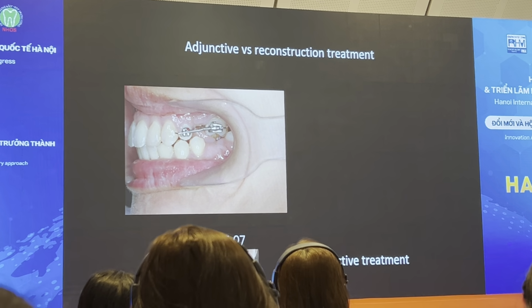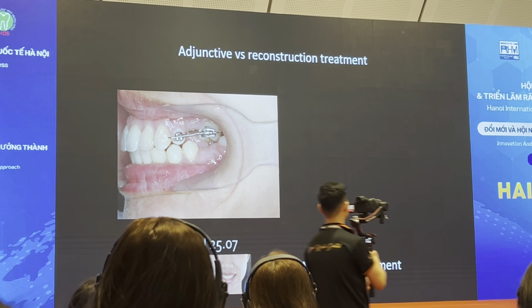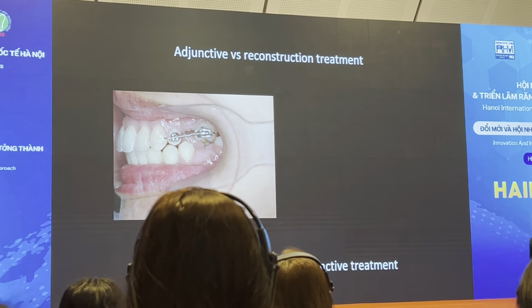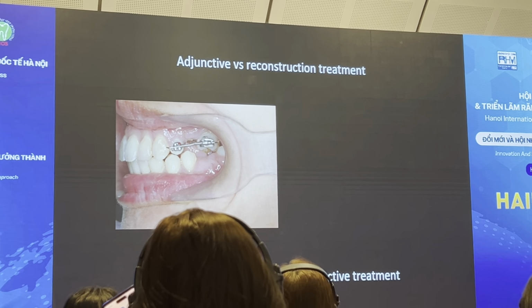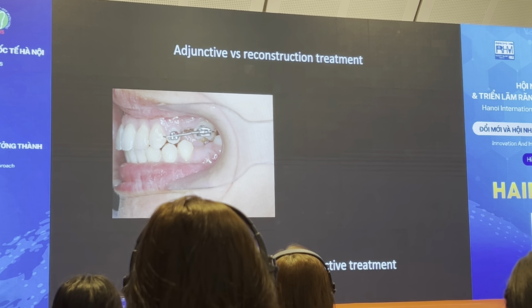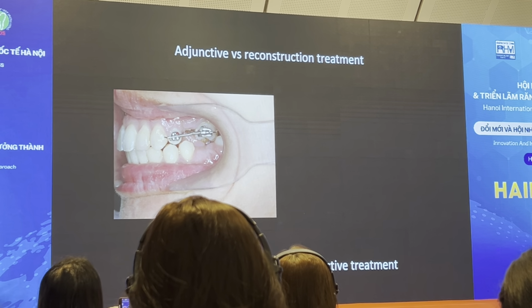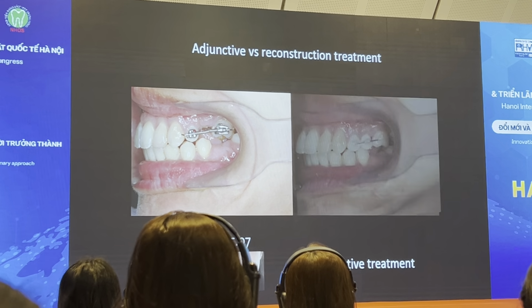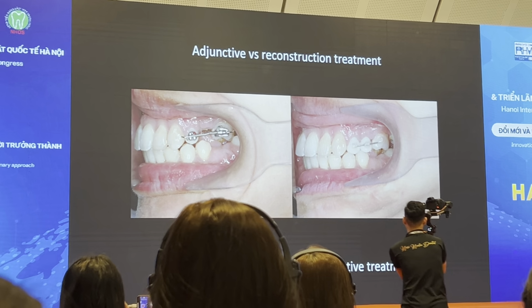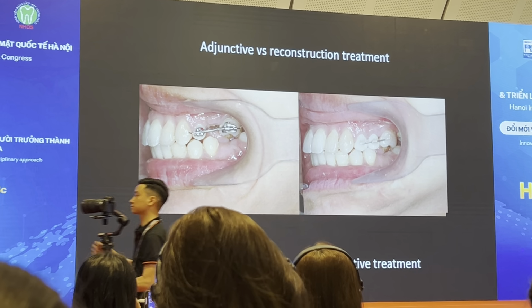A good example is the treatment I provided for Rachel after her comprehensive orthodontic treatment. I bonded the brackets to the implant-supported crown at 2/4 and to 2/6. A stainless steel wire was fully engaged into the bracket slots passively, and an opening coil was used to create extra space. Only 2 months were used to open space for the replacement of 2/5.